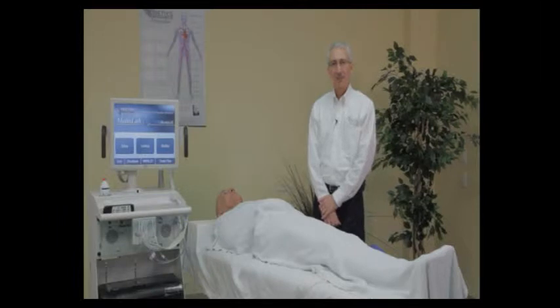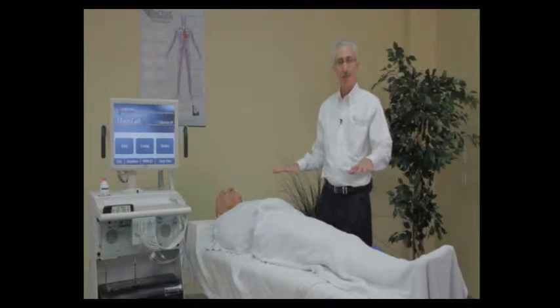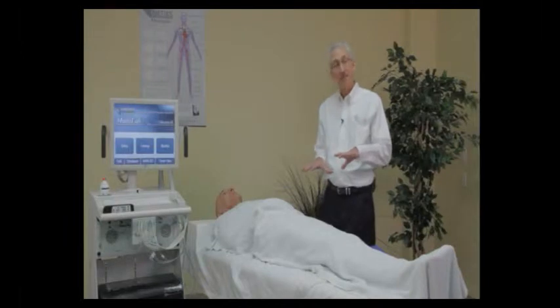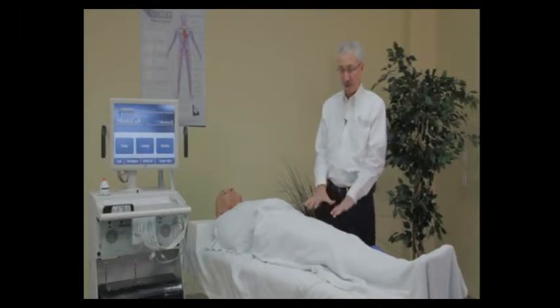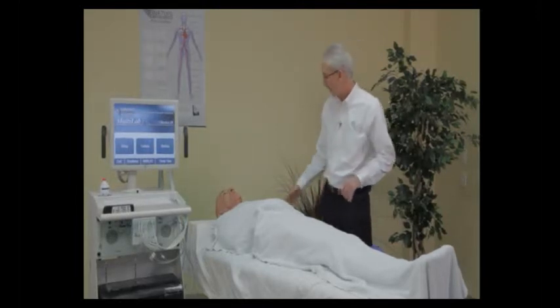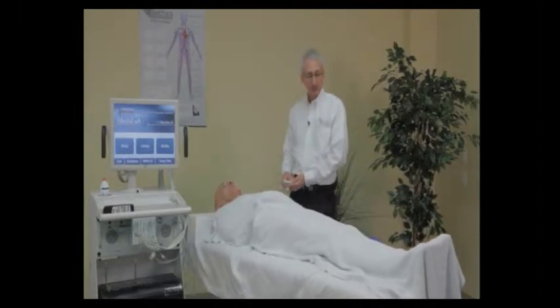In this portion of our video, we're going to be talking about vascular basics: patient positioning, room temperature, and comfort for the operator. My patient is being covered by a blanket with no cuffs on — I want him to stay warm before we begin the examination. Also think about bed height. As a taller person, this is not an ideal height for me to perform the study, so I'm going to raise the bed up. Little things like this make a big difference in your final results.